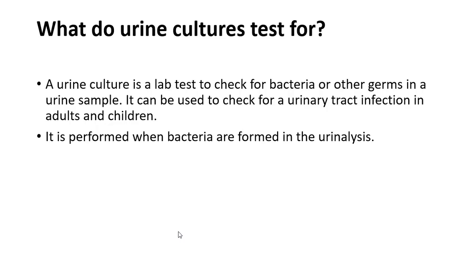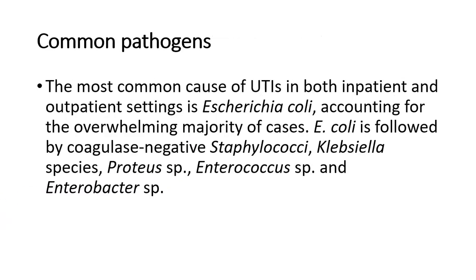So urine culture is to check for these bacteria in the samples. And in adults and kids, it doesn't make any difference. We can do newborns, as long as the specimen is good. And it is performed when we find these bacteria.